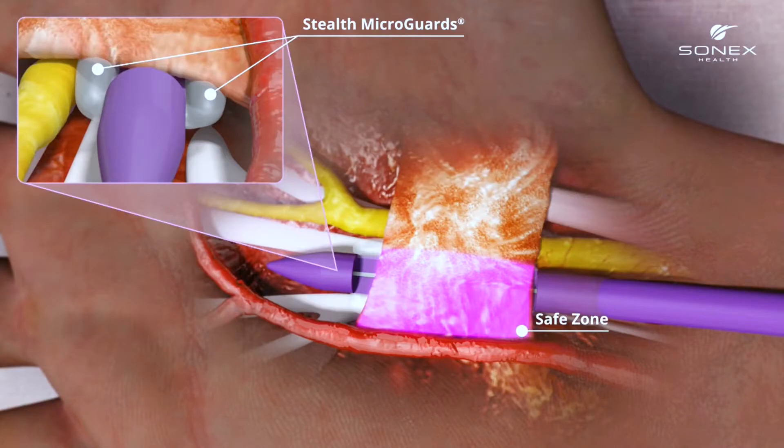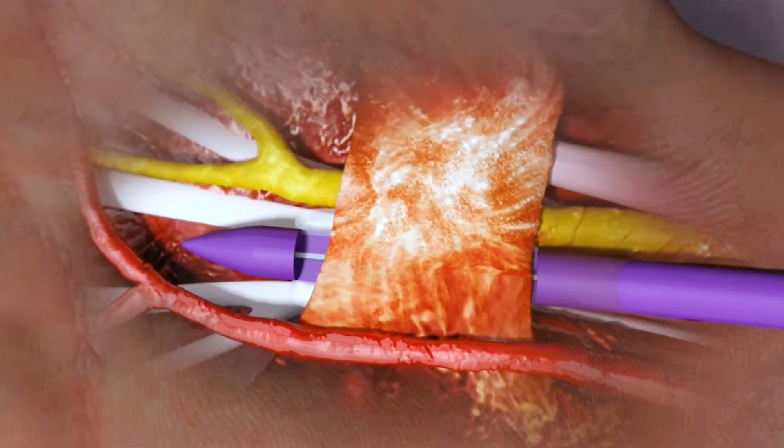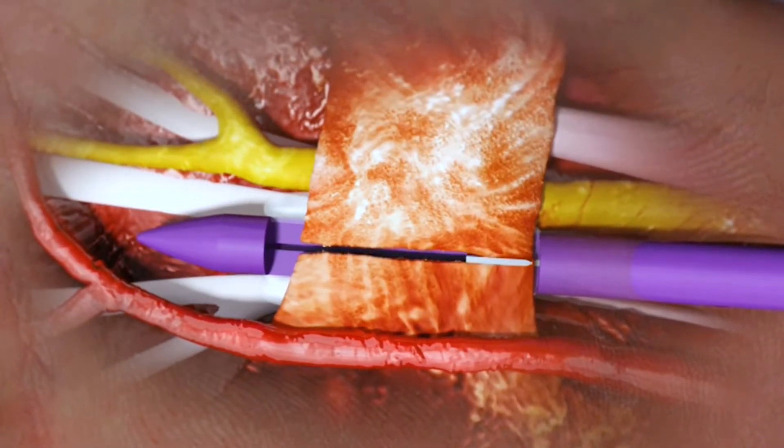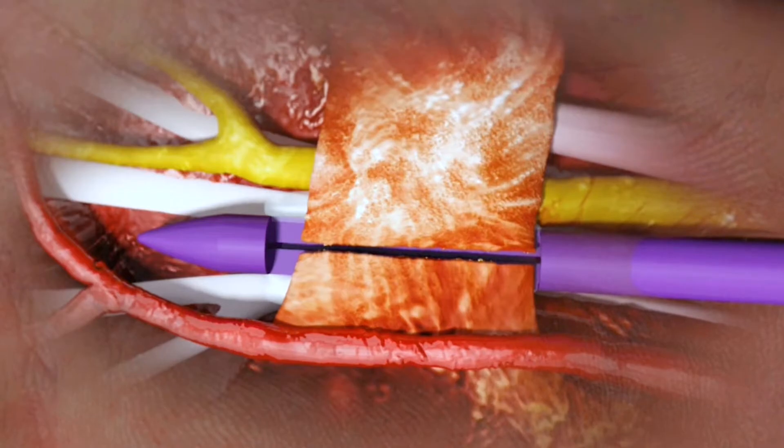The blade comes up, cuts the ligament, and then retracts itself back again, so you don't have to worry about a blade in there causing any kind of nerve damage or vascular damage.